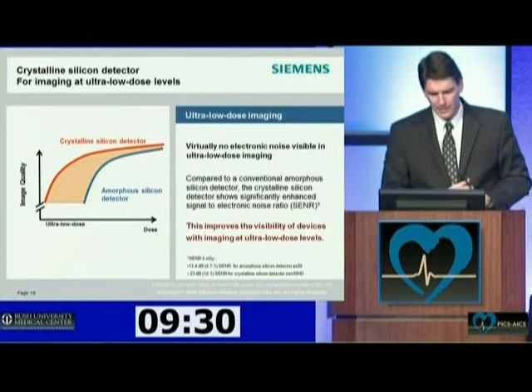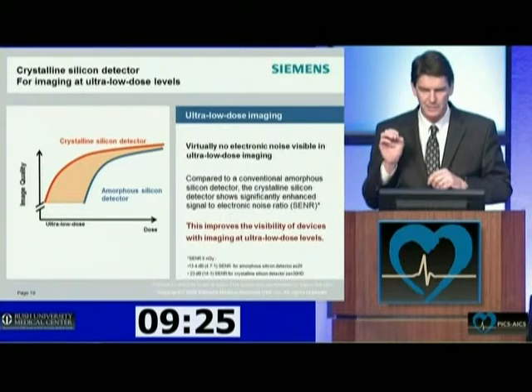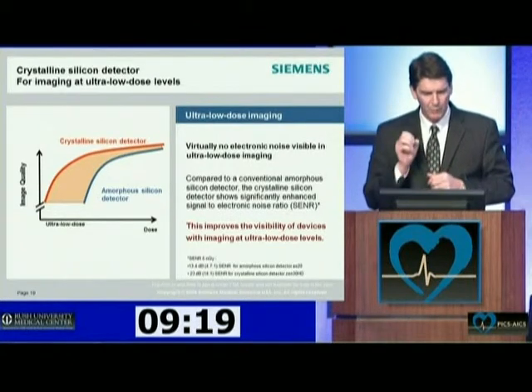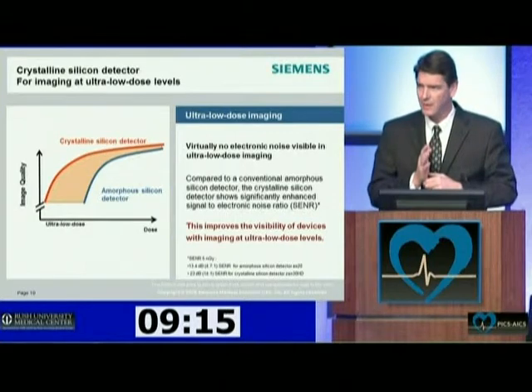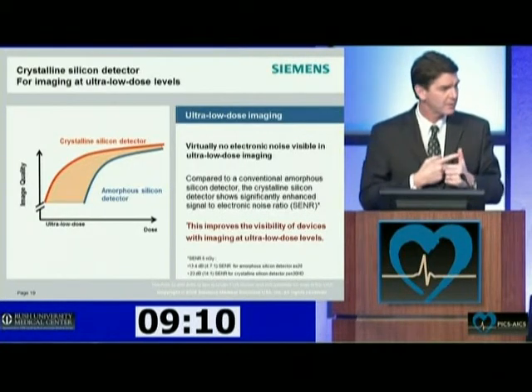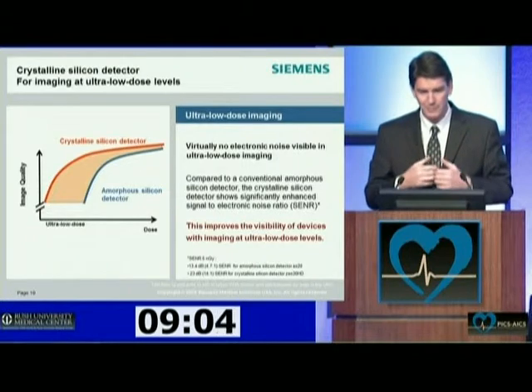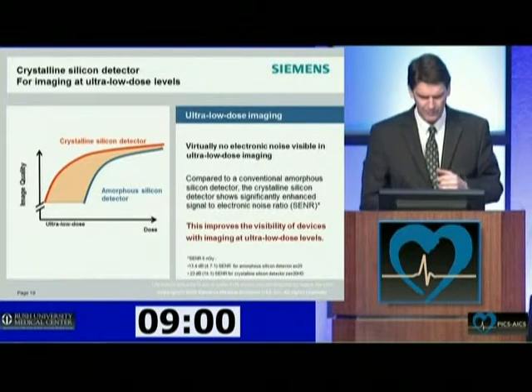So if you look at the dose spectrum, if you were doing just acquisitions, there's a fairly minimal difference between these two technologies. So when you move over to the right-hand side of this graph, but where it really has its impact is when you get into the ultra-low dose range. So this has the promise of being able to dramatically reduce radiation dose without a significant reduction in image quality. And I think, once again, this is something which from my perspective, has the most promise in the pediatric cardiology environment.